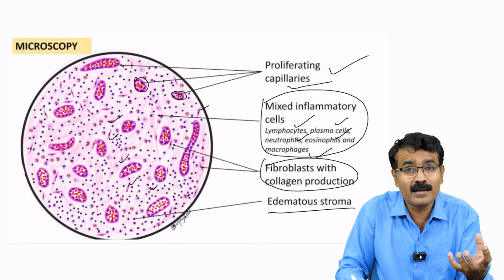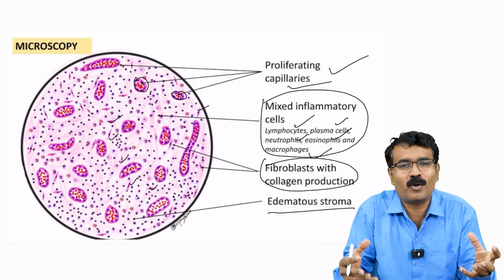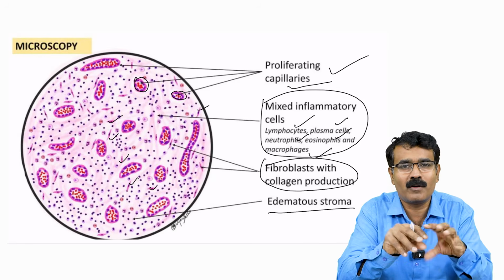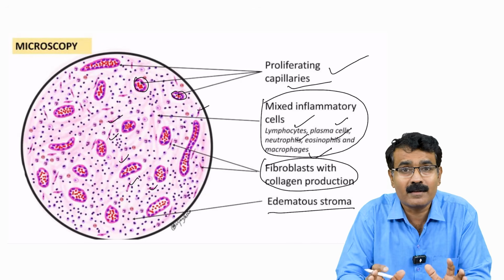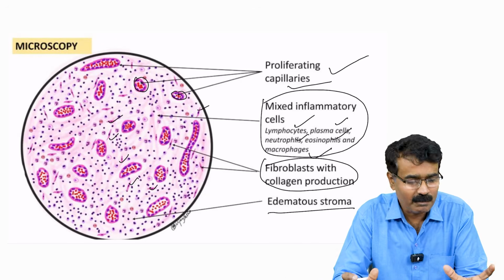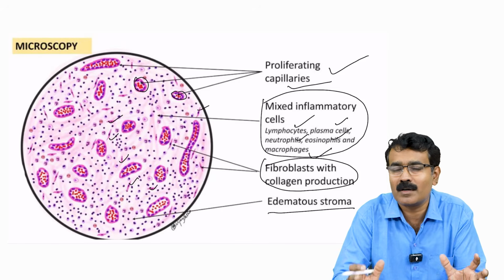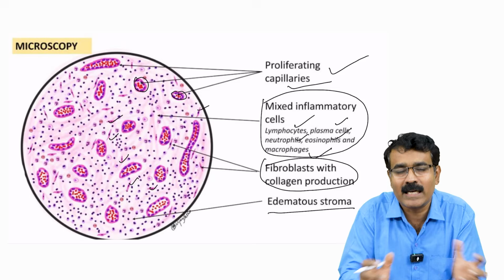And the stroma in the early stages is always edematous. Just have a loose edematous stroma. How do you show a loose edematous stroma? All you have to do is write chronic inflammatory cells here and there. That's all. That's how you write granulation tissue. So how is this different from a capillary hemangioma? Capillary hemangioma is a tumor of blood vessels, you know that. They are also composed of capillary-sized blood vessels.